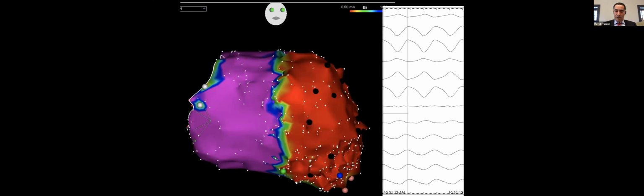If you have isolated the core, then you induce again. And if there are other VTs, you target those additional VTs, either by expanding the core or focally ablating them, going to a different chamber. And if you haven't yet isolated the core, then you do additional ablation, you do activation mapping to figure out where the gap in your lesion set is. Okay, so this is an example.